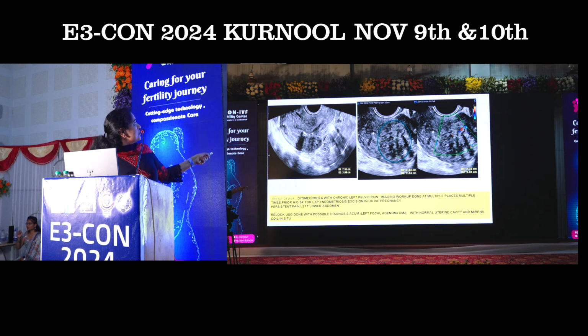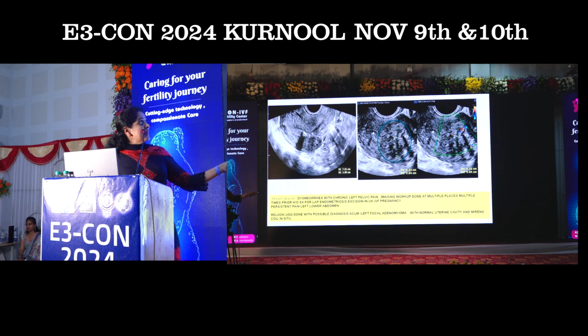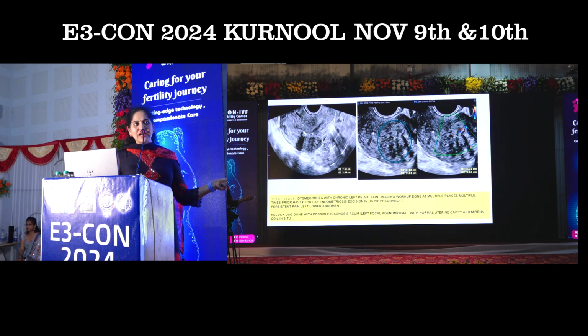Now you look into this uterus, there is a focal abnormality. Now you zoom in and look into the focal abnormality. Are you able to define a capsule? No. Are you seeing an edge shadow? No. You are seeing internal patchy echotexture, no circumferential flow. So the pattern recognition of this was looking like a focal adenomyotic area in the left-sided lower zone.